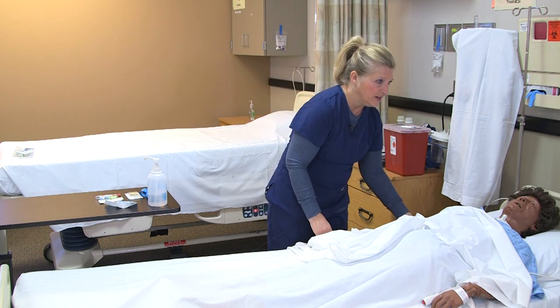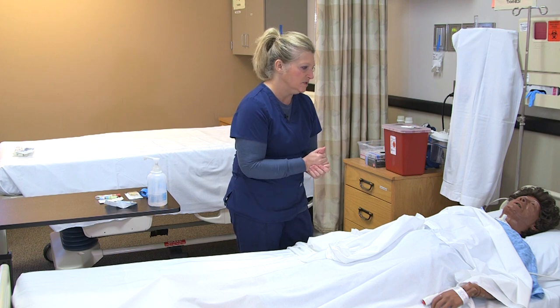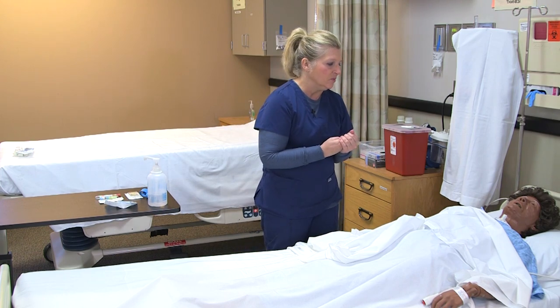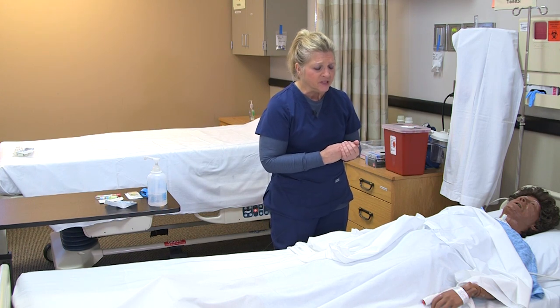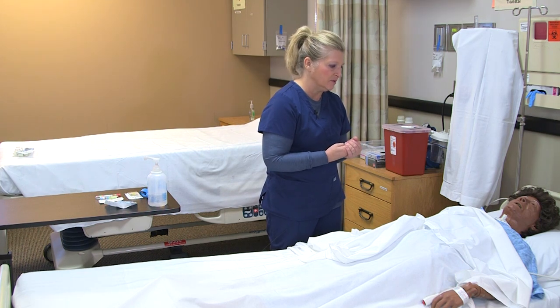The patient verifies who they are, confirming this is the patient I need to draw blood on. Before drawing blood, I check the provider's orders to make sure the appropriate blood is being drawn for the patient's condition, and I look to see what types of laboratory values the provider is looking for.